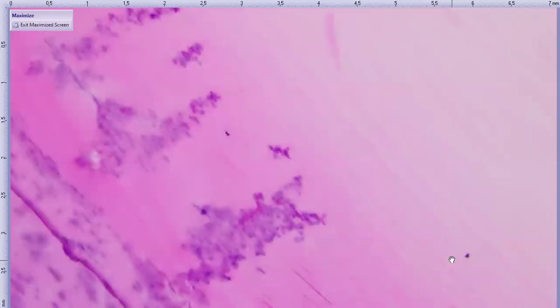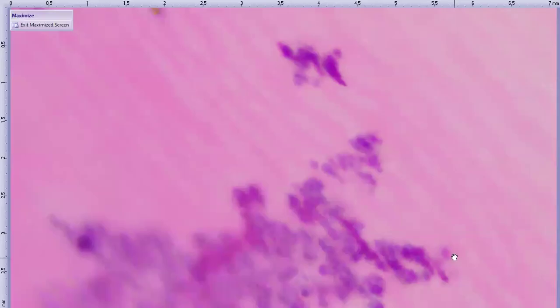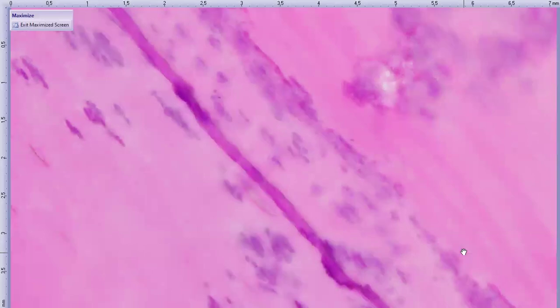And when we go higher mag, this is actually bacteria, or what I think is bacteria. So these are like giant lobulated coalescing colonies of bacteria. It doesn't show up all that well here, I should say. And interestingly, at this level, we don't have a break in the lens capsule, and there are also no inflammatory cells associated with this material.